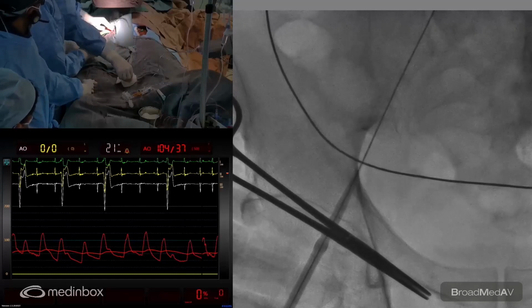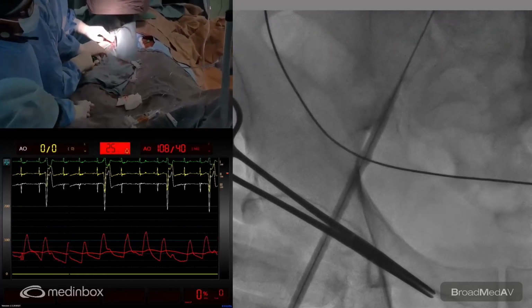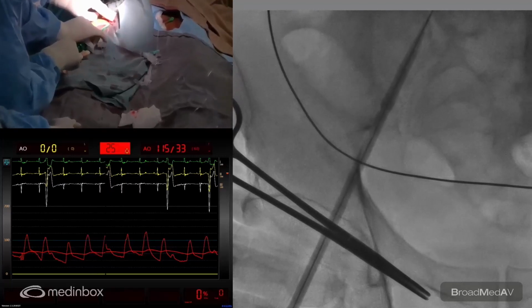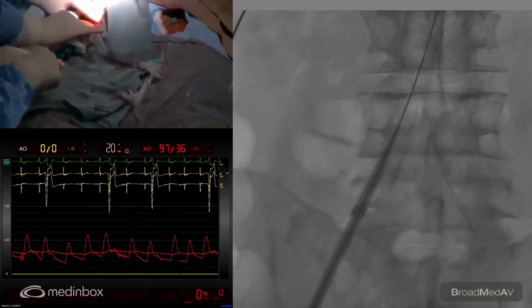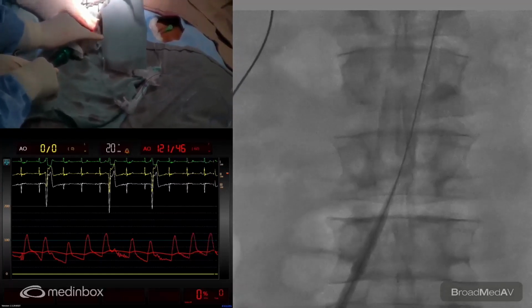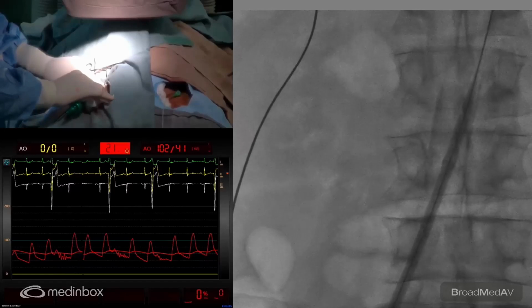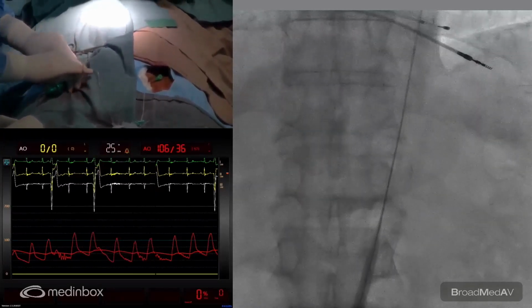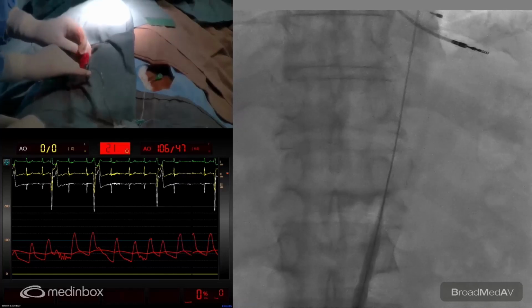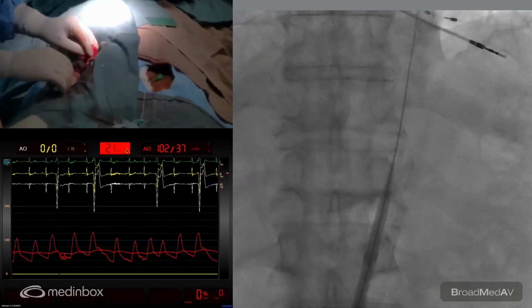We'll go in very, very slowly now. Very important we do that slowly. So I'm putting a gentle tug on the wire as Ashish goes up. Please follow the sheath. So go up, please. So you see it's very smooth. I'm all the time watching the aortic pressure, and we're very happy with that pressure. Nothing is happening on the pressure side.